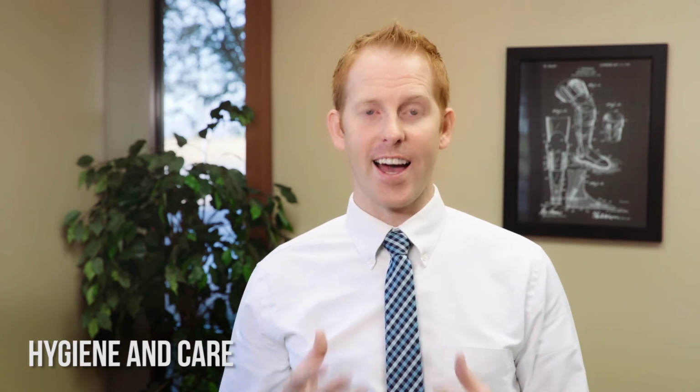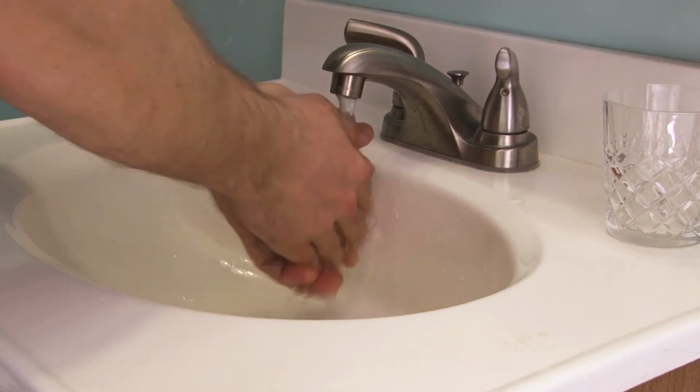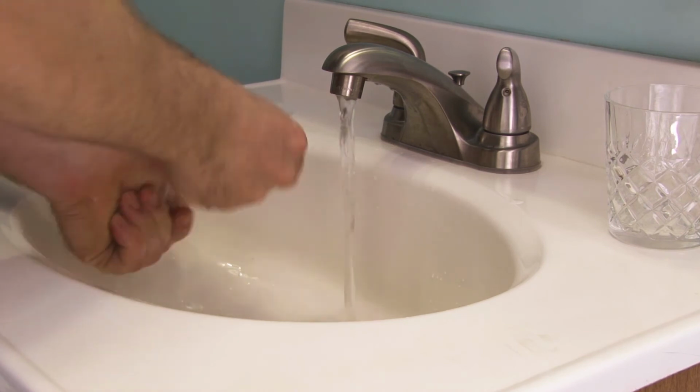One of the most critical elements in working with an osseointegrated patient and limb is good hygiene. The stoma, or opening around the dual cone adapter, requires some extra attention and care to ensure that it remains healthy and not susceptible to infection. The most important step to remember is to wash the opening twice daily with soap and water.